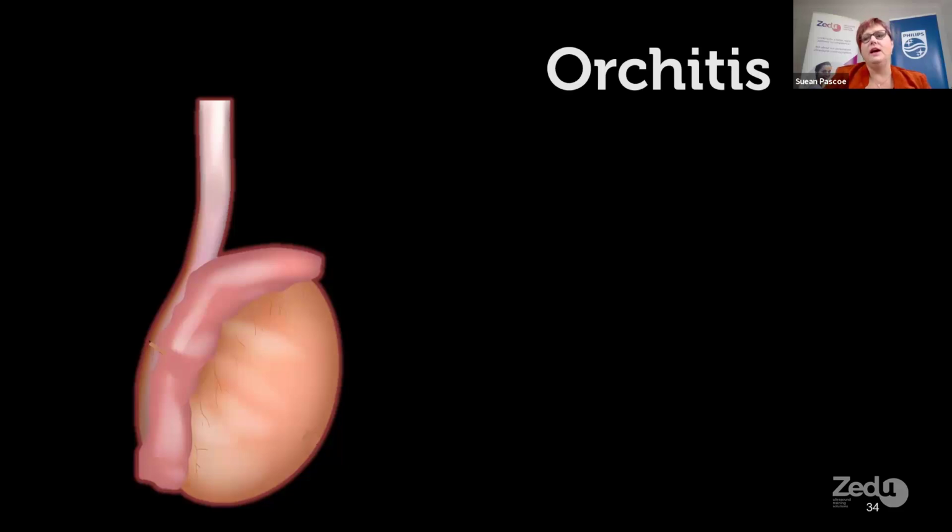And so if you can't optimize the image well and you can't hold your hand still, the chances that your pulse wave Doppler trace are going to be anything useful are very slim. And I just don't think that is the purview of the point of care exam. And even more so when you're dealing with the pediatric testis, where you've got a smaller target. Yeah, and a wrigglier target.